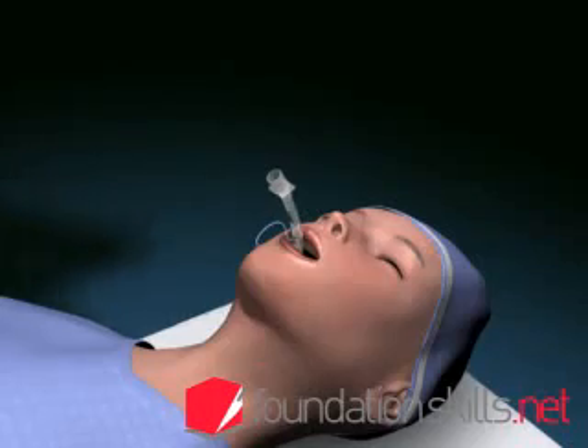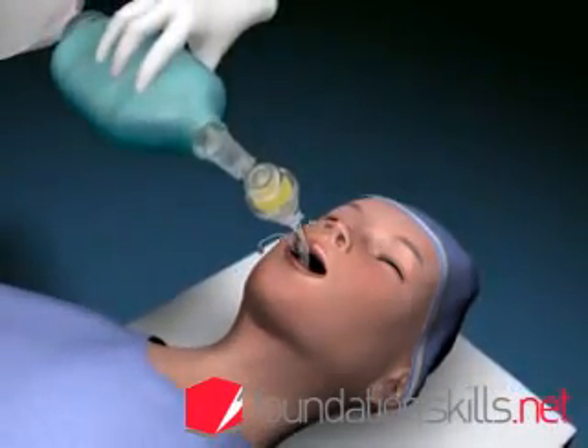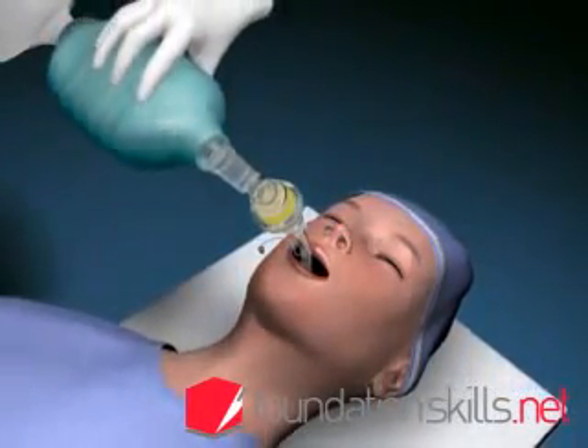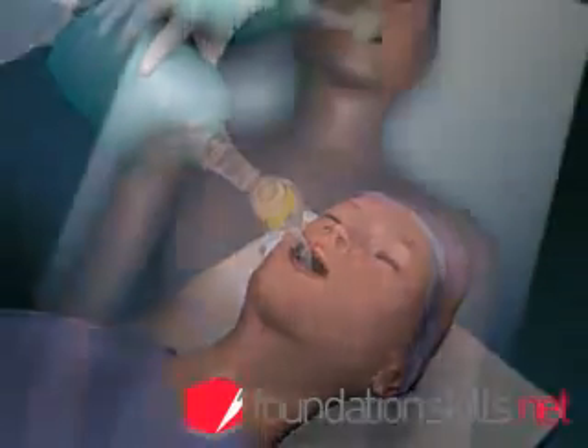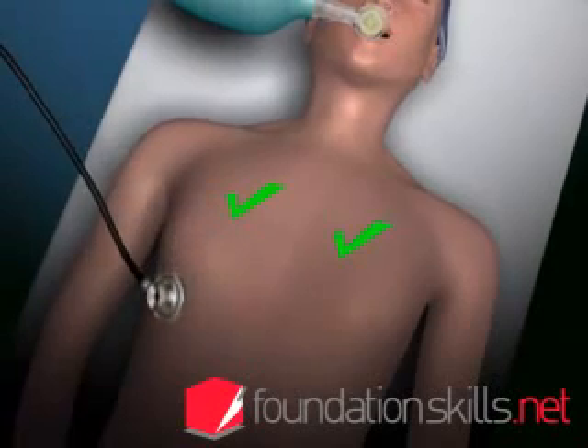Attach the tube to the bag and valve apparatus and ventilate the patient with the oxygen flow on 12 to 15 liters per minute. Confirm the position of the tube by auscultating over the apices of the lungs, the axillae, and the stomach.